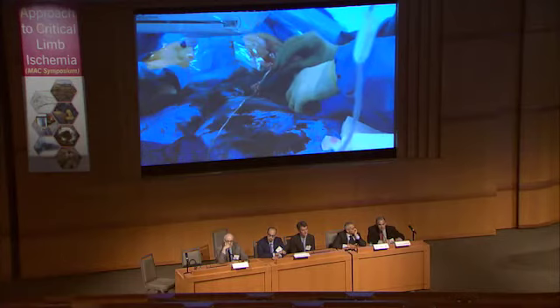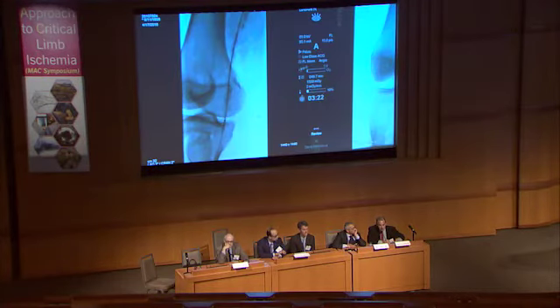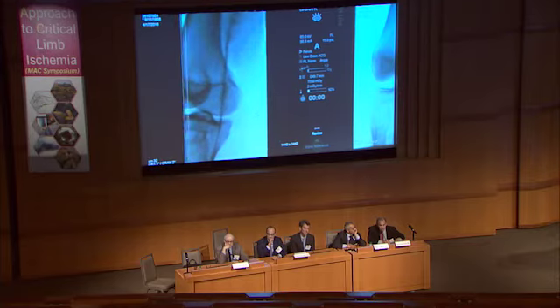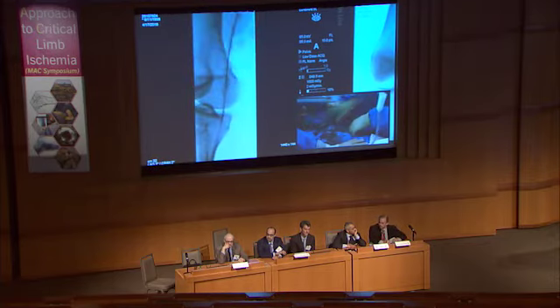If it's longer than that, patency rate falls. If it's shorter than that, it falls a little bit, but it's not so bad. But elongation is a big problem, and that's related to how well you prep the vessel. Sometimes you can even stack it, and over time, if the two ends are roughly at nominal lengths, it will help to reorganize itself. But if it comes out really long initially, it's very difficult to straighten that up in the future.